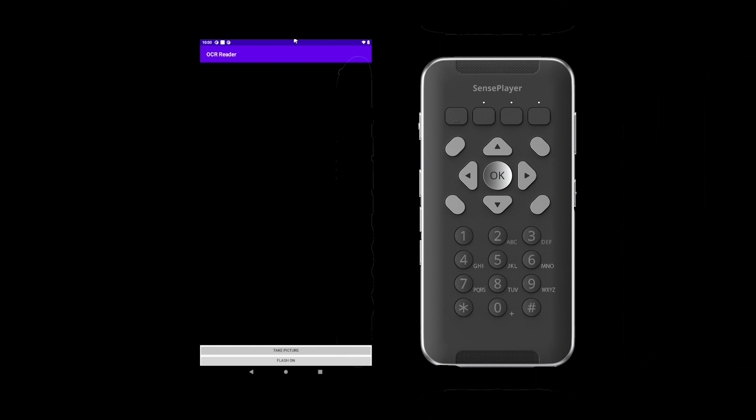All keys will be facing up so the camera is facing down. For best results, if the Sense Player is in landscape mode, the text material should also be in landscape mode. If the text is in portrait orientation, the Sense Player should also be in portrait orientation. To take a decent picture of a normal sheet of paper, the camera should be centered about 10–12 inches above the page.